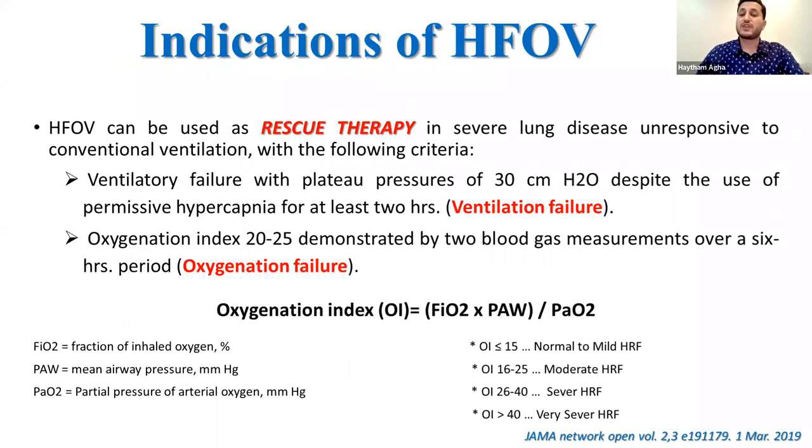So what are the indications of high frequency? One of the biggest indications is using high frequency as a rescue therapy. That means that you are using high frequency after failure of conventional mechanical ventilation. The failure of conventional ventilation can be divided into two parts: ventilation failure and oxygenation failure. Ventilation failure means you have permissive hypercapnia, pH less than 7.25, despite high CO2 and using a high plateau pressure of more than 30 for 2 hours.